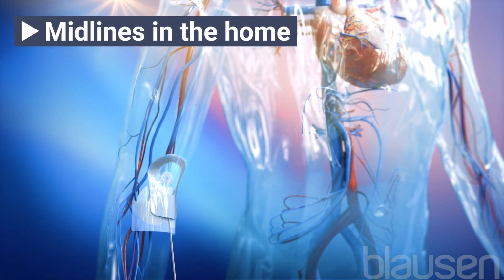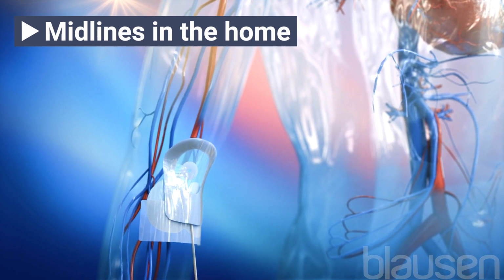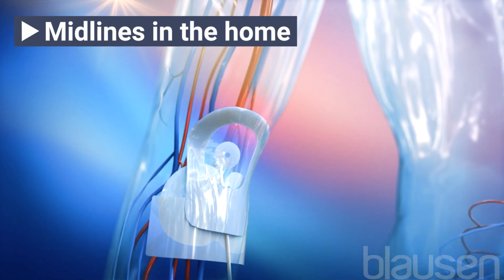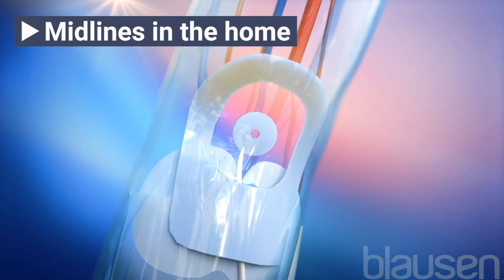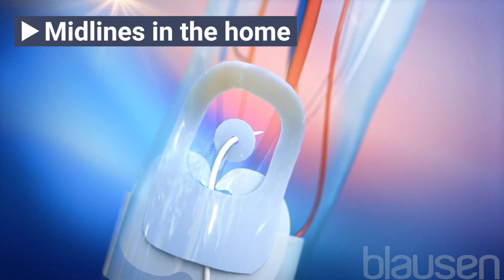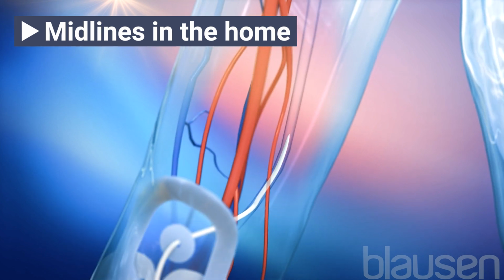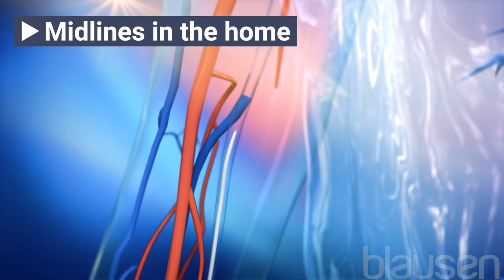Some patients may have a midline in the home. These midlines are a special type of peripheral IV because they go into one of the veins in the upper arm and end typically in the armpit. They are up to 8 to 10 inches in length, although only a few inches of the midline are outside the skin. Midlines can be placed in a hospital room, a clinic, or a home. Not all medications can be put in a midline, and midlines may not last as long as some other IVs. For this reason, not all patients can use midlines in the home.